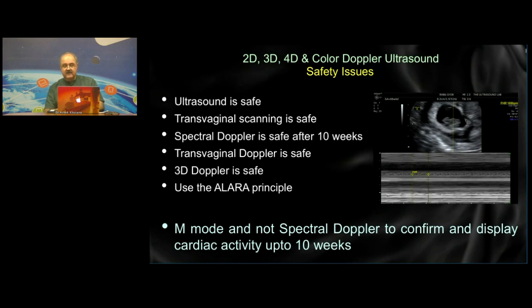Remember that here at the top of every image, we also have readings that tell us continuously how much heating is going on and what is the amount of energy being transferred to the tissue. You need to keep an eye on that. You can set a lock on it and then you'll never go wrong. And therefore, we have now a completely safe situation.